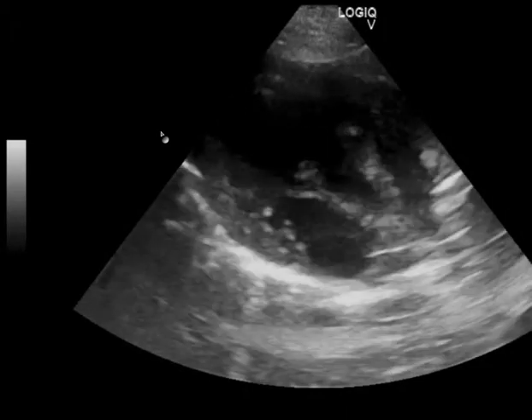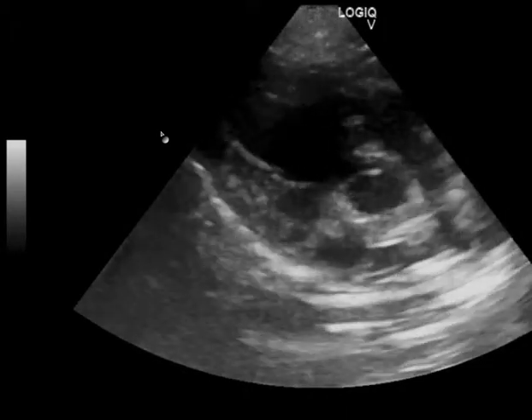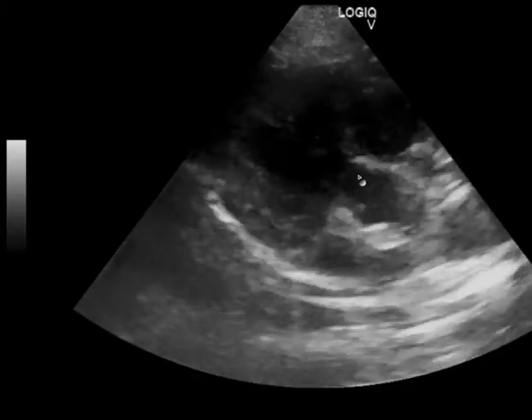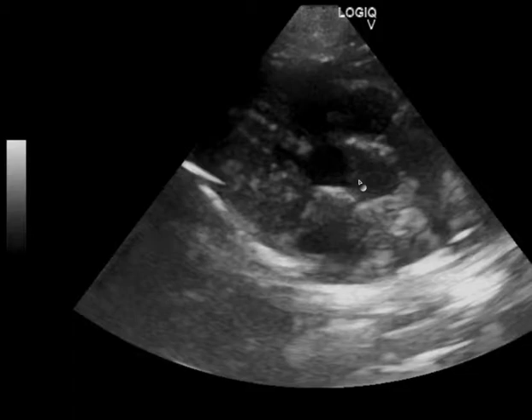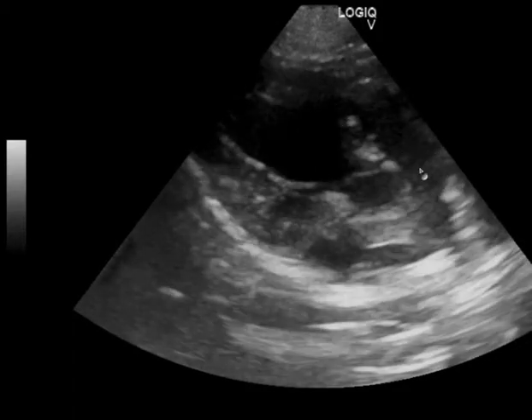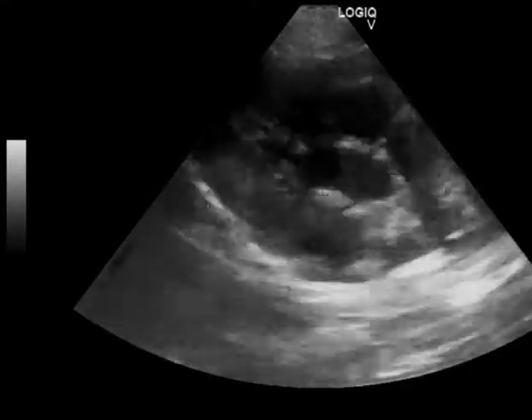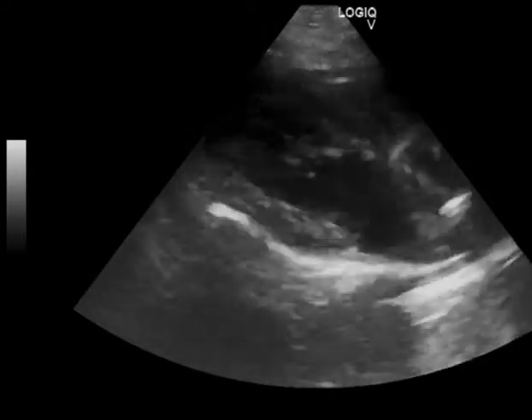This is kind of an oblique five-chamber. I can subjectively see that the LA to AO ratio is one to one. On the June Boone measurement your LA to AO ratio should be something like 1.1 to 1.15. But you're still tilted — you have to slide towards the spine and flatten out that left ventricle and put that LA to AO right in the middle of the screen. If you were to drop your cursor here you would be offline — you have to have the aorta centered with the left atrium right underneath it and the cursor coming down the middle.